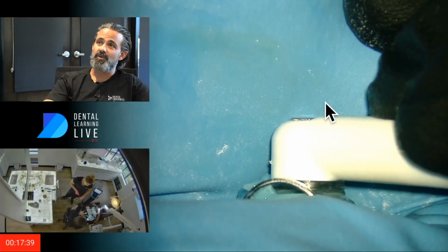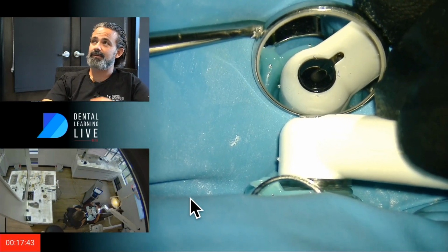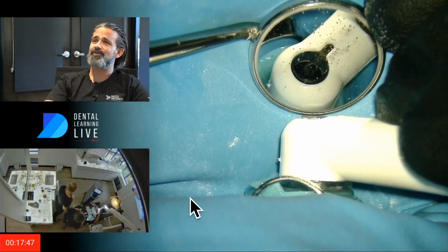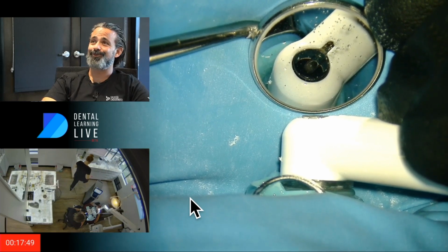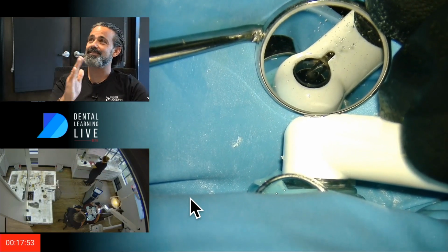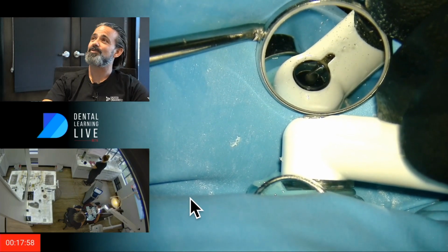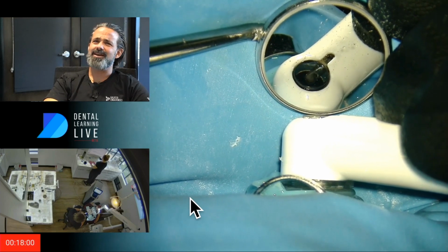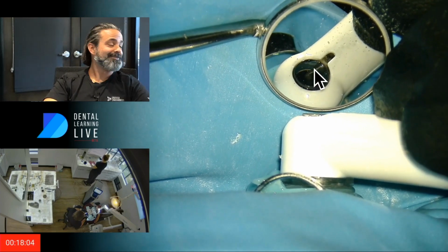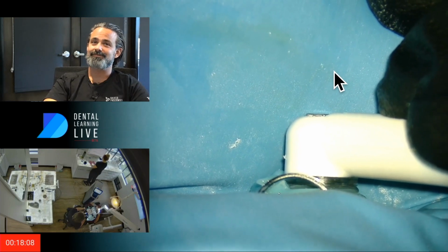You can see Lindsay wiping that down over here in the corner. Passing it back. And then it'll just splatter on it again. Hard wiping work is all for nothing. Wipe it again. It's like your windshield wipers, right? You want to just wipe it all the time. Spin your mirror around, make it go clean. You could do that. Rotating mirror, right? Rotate the mirror, keep a little bit like a fan so it keeps the splatter off.